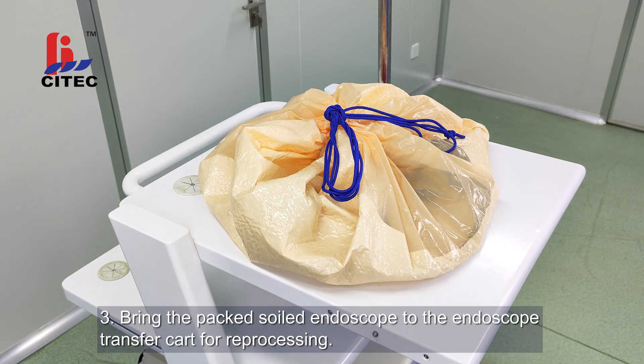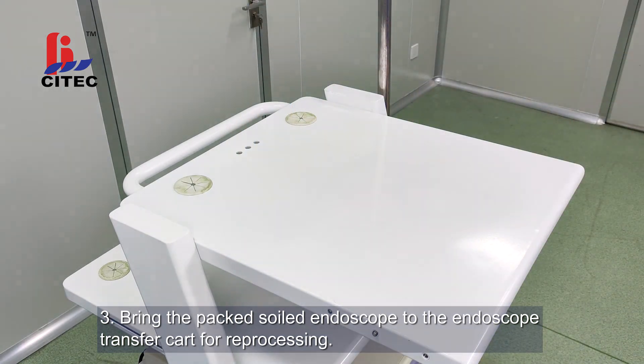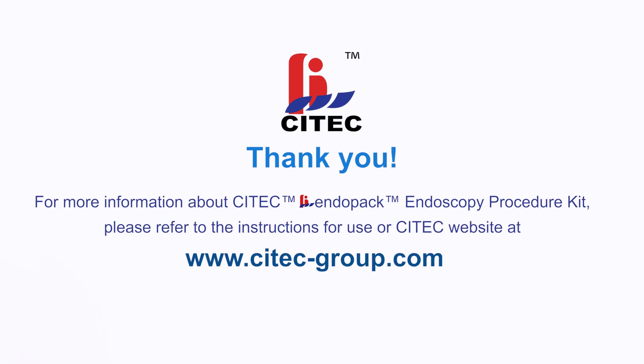Step 3: Bring the packed endoscope to the endoscope transfer cart for reprocessing. For more information about CITEC Endopack Endoscopy Procedure Kit, please refer to the instructions for use or the CITEC website at www.citec-group.com.